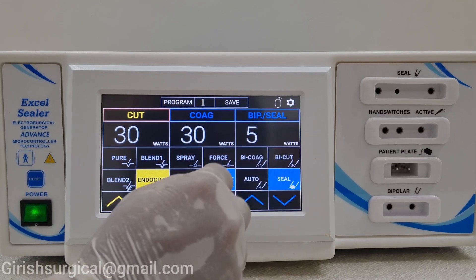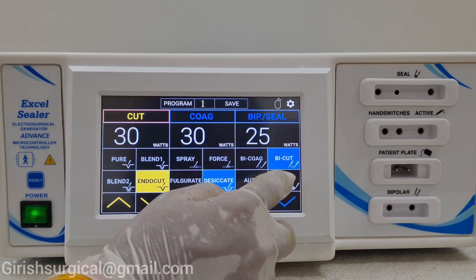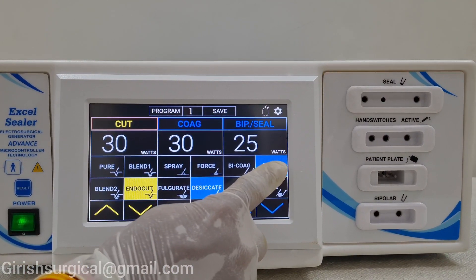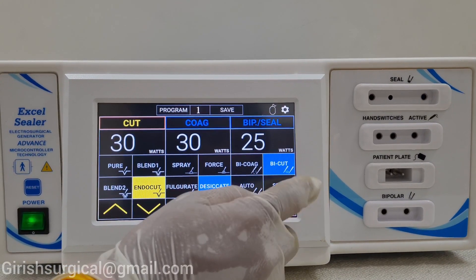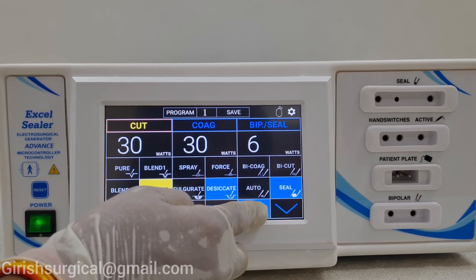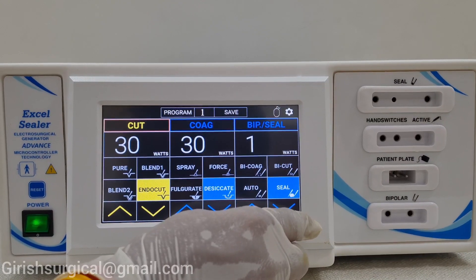Now in the bipolar and sealer mode — suppose we are doing bicoagulation, the output can be increased or decreased. Now the bi-cut: if you are using a bipolar scissor, you have to insert the bipolar scissor here — this feature is used only for bi-cut, meaning when you are cutting the artery, blood won't come out. In auto mode, it will stop automatically when you are doing the coagulation. On the seal mode there is level 1, level 2, going up to level 10. You can use the bipolar open laparoscopy instrument or the open sealer.